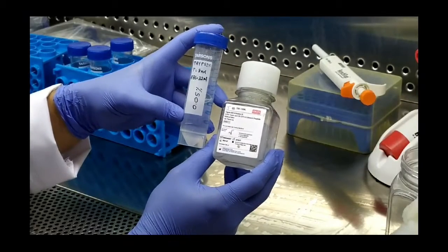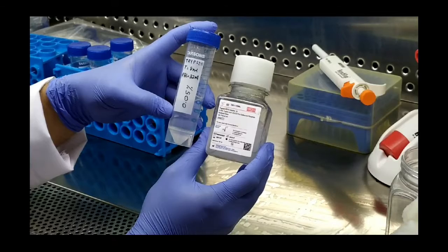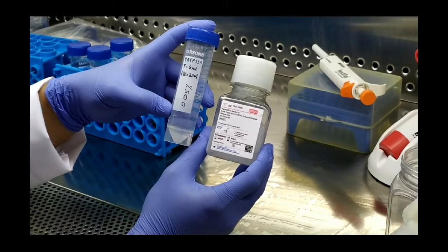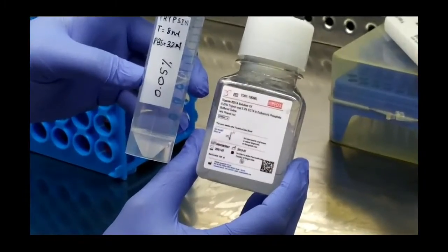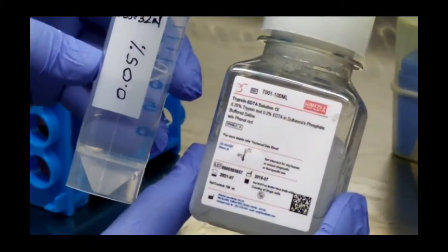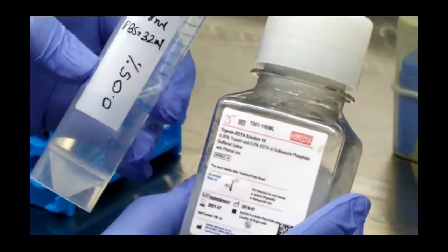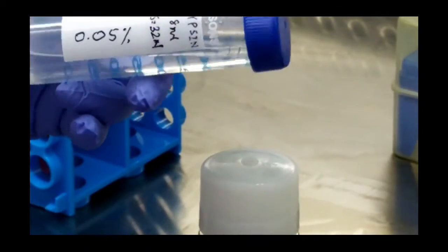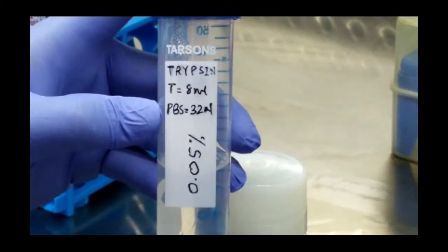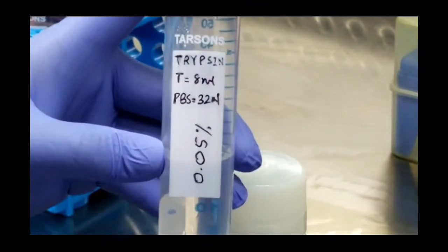Along with the media, there is one more solution required, known as trypsin. Trypsin is an enzyme which helps to detach the cells from the substrate, and cells which are attached to each other also get detached after treatment with trypsin. The stock of trypsin available is 0.25% in EDTA and phosphate buffered saline solution. The working concentration required for trypsinization of the cells is 0.05%. So we have made a working solution of trypsin by adding 8 ml of stock and 32 ml of PBS — phosphate buffer saline — which is sterilized, making a final working solution of 0.05% trypsin.